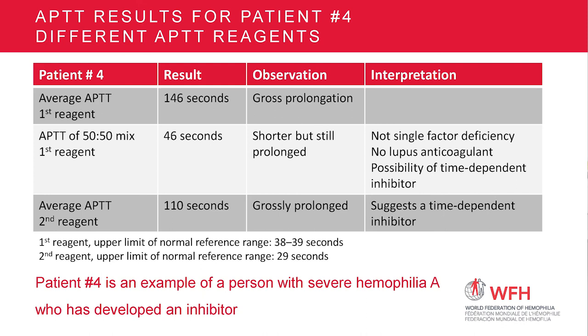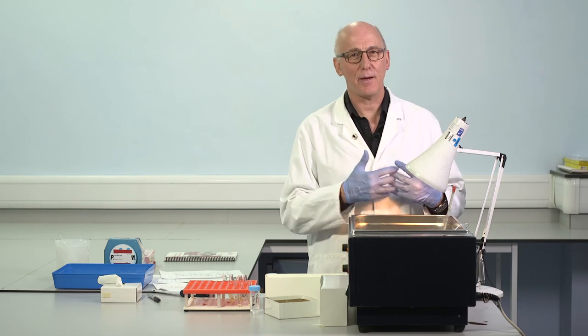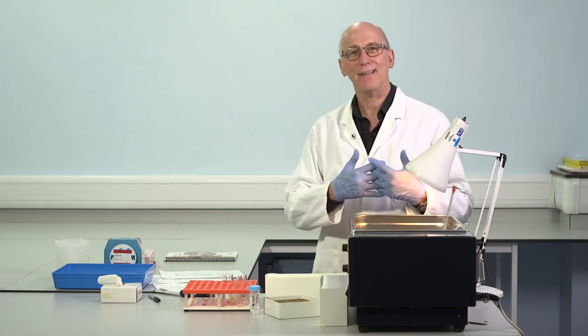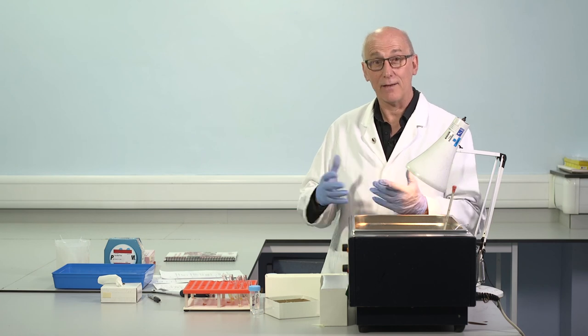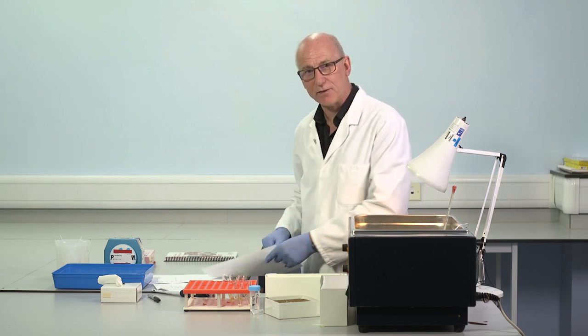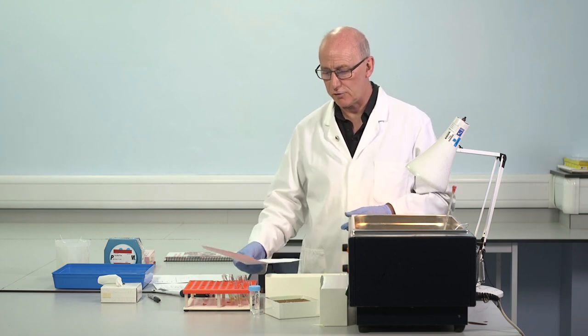Actually, this is a severe hemophiliac, congenital hemophilia, a patient who developed an antibody following replacement therapy. Congenital hemophilia, antibody secondary to therapy. And that's a fairly typical pattern. If we had incubated that mixture in the water bath, 1 hour, 2 hour, we would have seen that 46 seconds increasing, 70, 80, 90 seconds over time. That's a classical picture in relation to congenital hemophilia with an antibody. And that's a patient where we would make the specific inhibitor test in order to quantify the antibody. It's important to know the concentration.